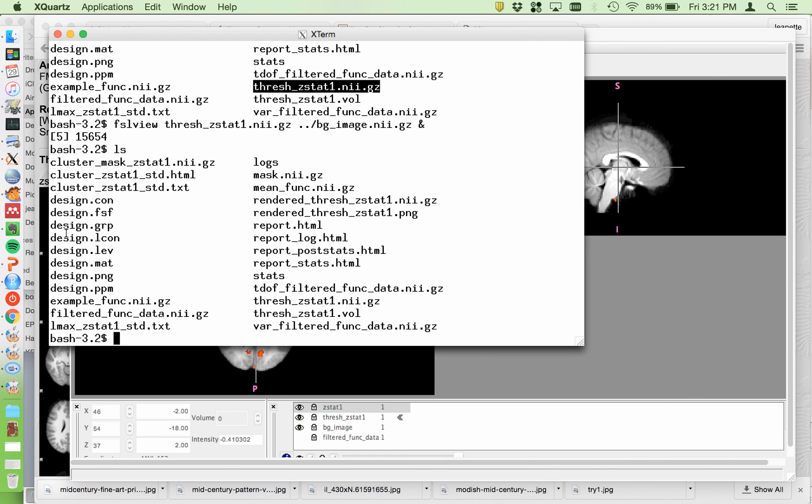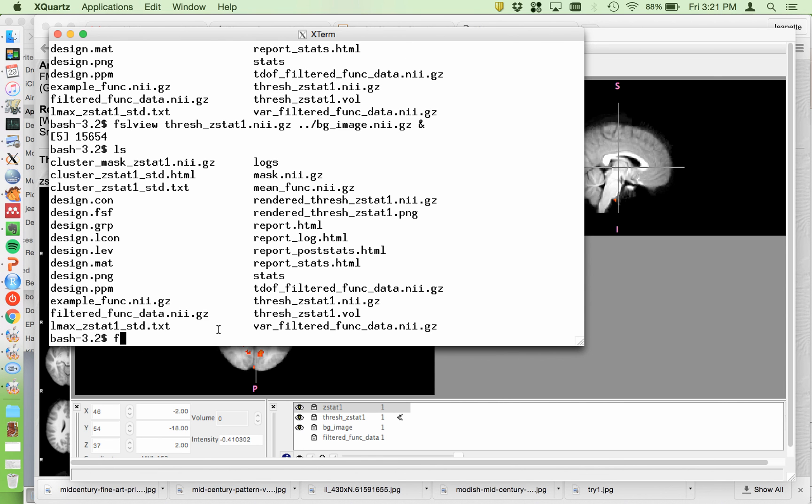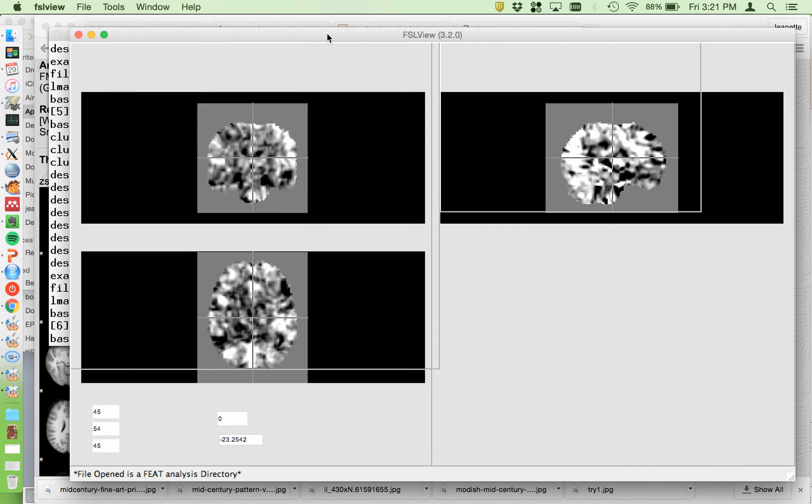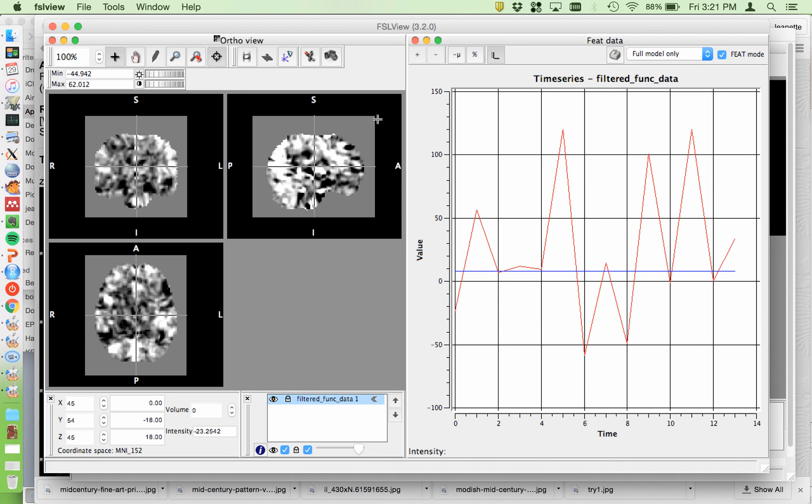Let's see what else is in here. The filtered func data is right here. So this is a good image to review to make sure everybody looks okay.